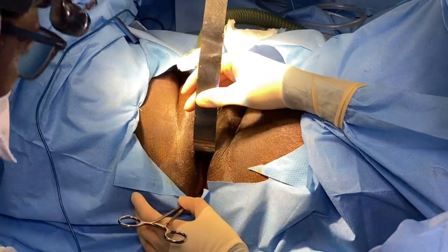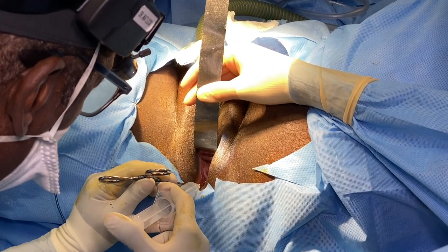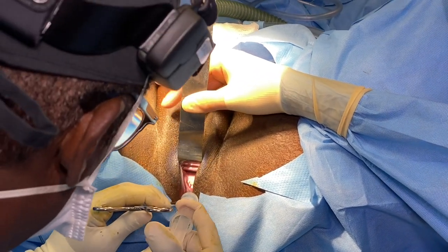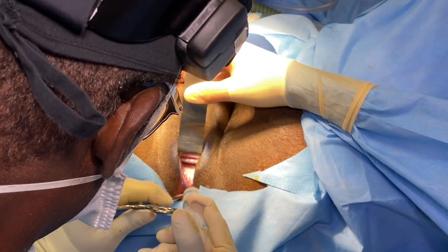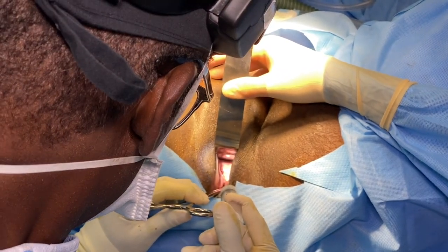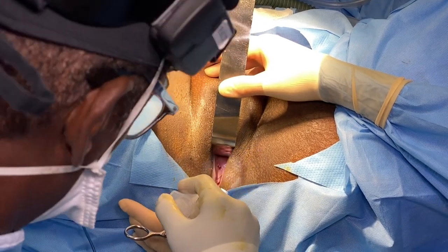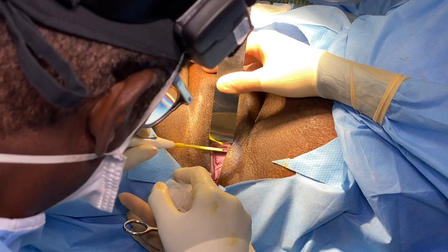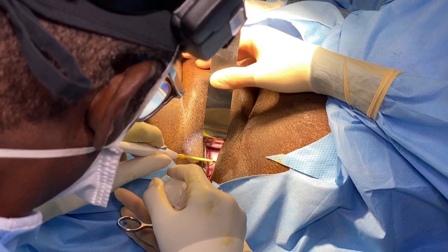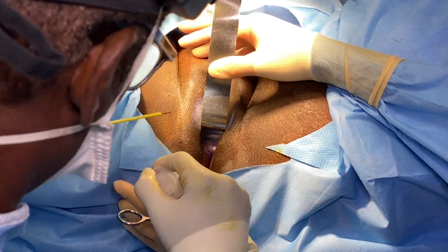All right, now what I'm doing, I'm placing what we call a tumescent solution. It's actually a solution that we use for liposuction. And this is going up under the submucosa so that it can prevent bleeding and oozing. So we'll continue this into the anterior wall, which is the top, posterior wall, the bottom, throughout. And then we will start the procedure. We'll bring you back in.